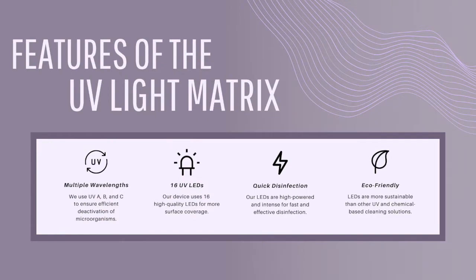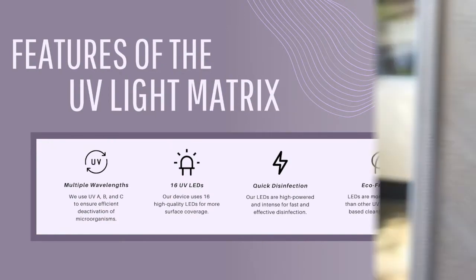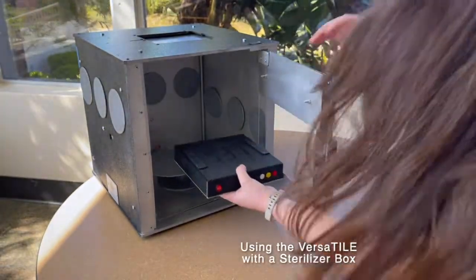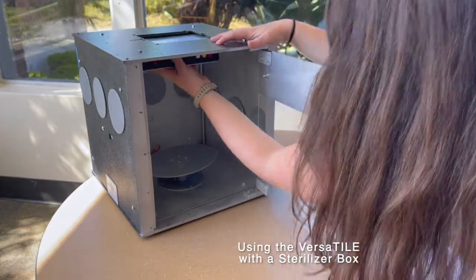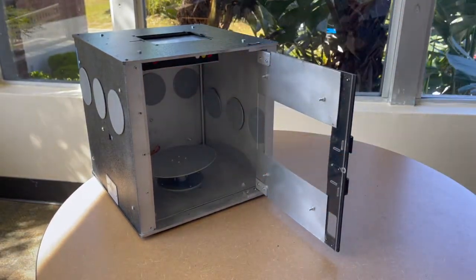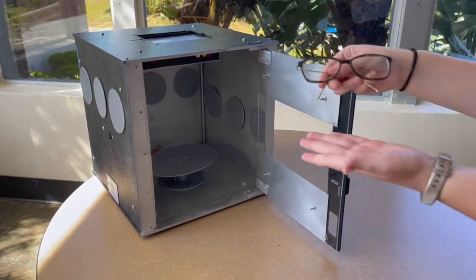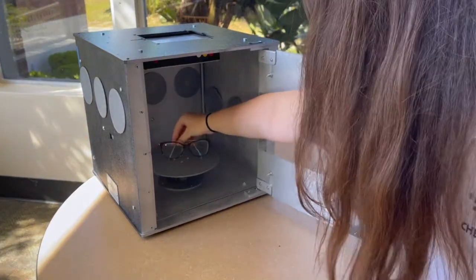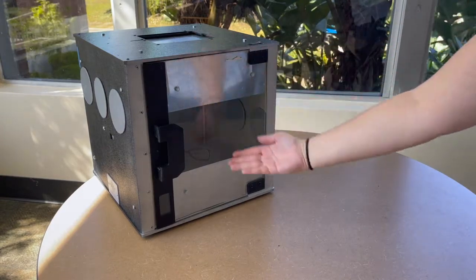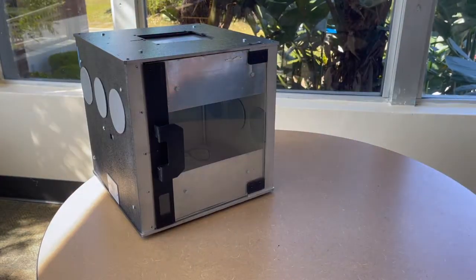Our light matrix includes six different wavelengths throughout the entire ultraviolet spectrum, as opposed to the usual single wavelength in most ultraviolet disinfection products. By combining these specific wavelengths, we are enhancing the germicidal reduction through exposure redundancy. Our matrix includes 16 ultraviolet LEDs, allowing a single Versatile to cover a larger surface area than most comparable compact devices.